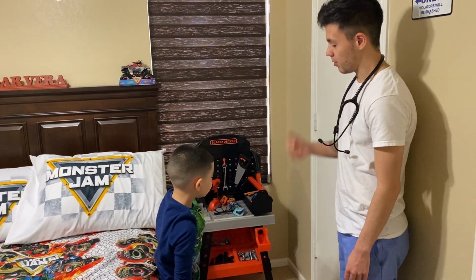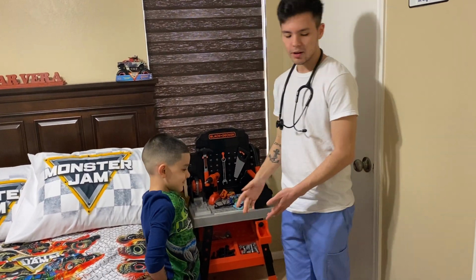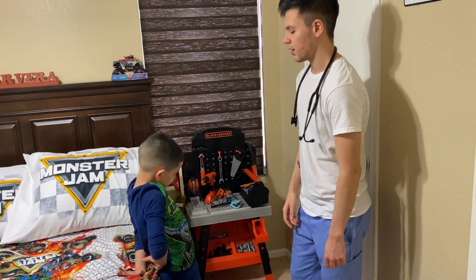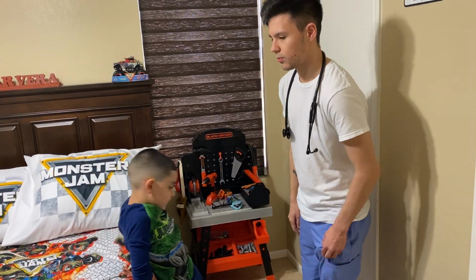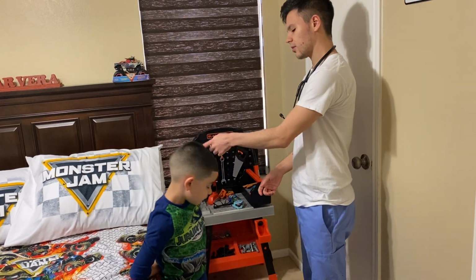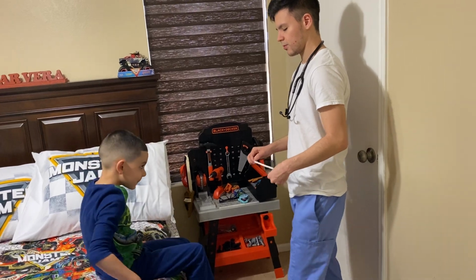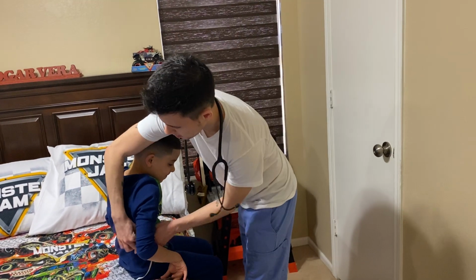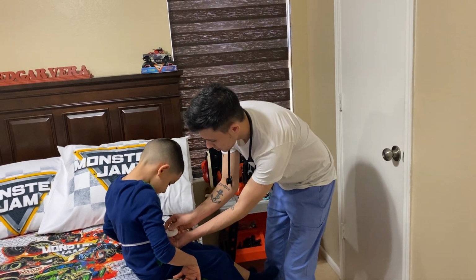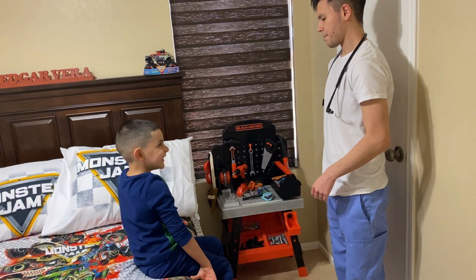Now, I'm going to take off the patient's shoes, and I'm going to weigh him, and at this time I would also assess his height. And then I'm going to assess the waist circumference. You can sit down. 21 inches. Okay.